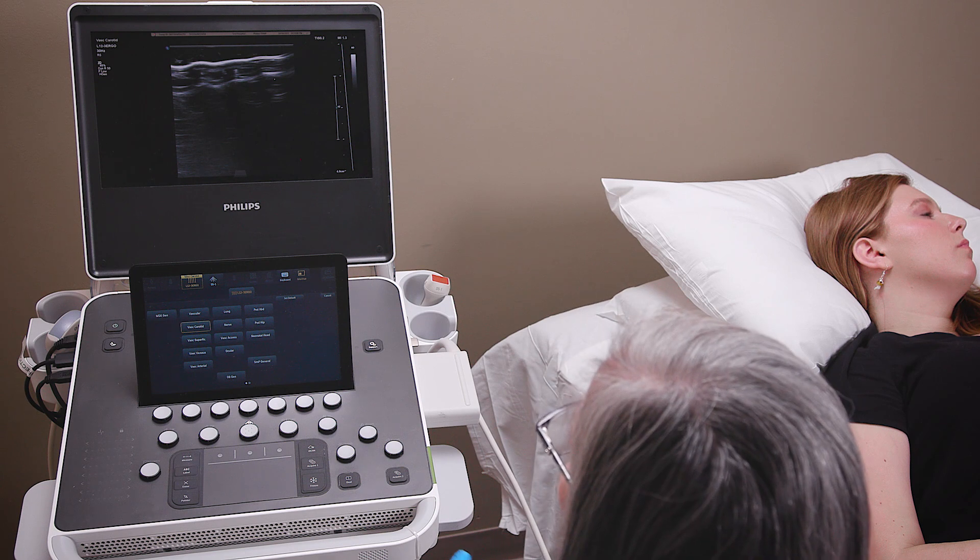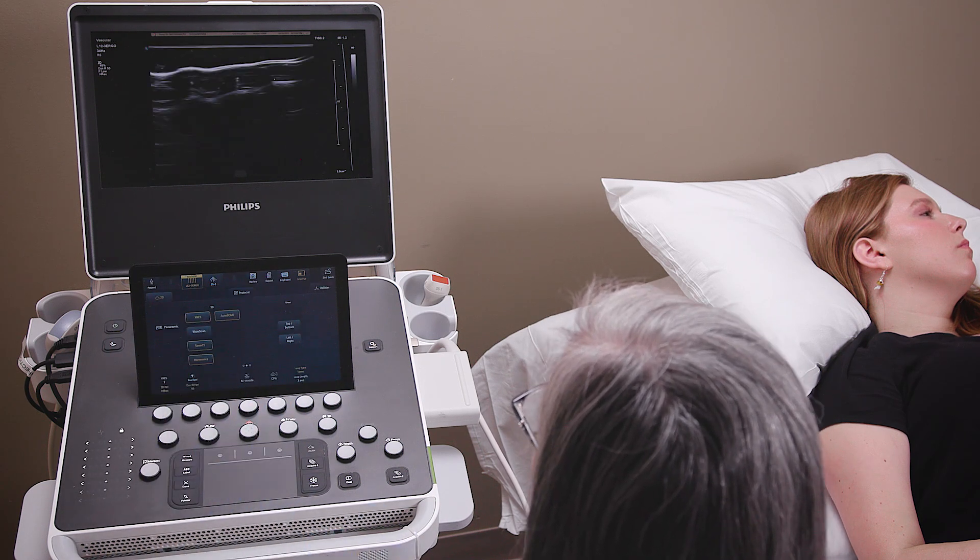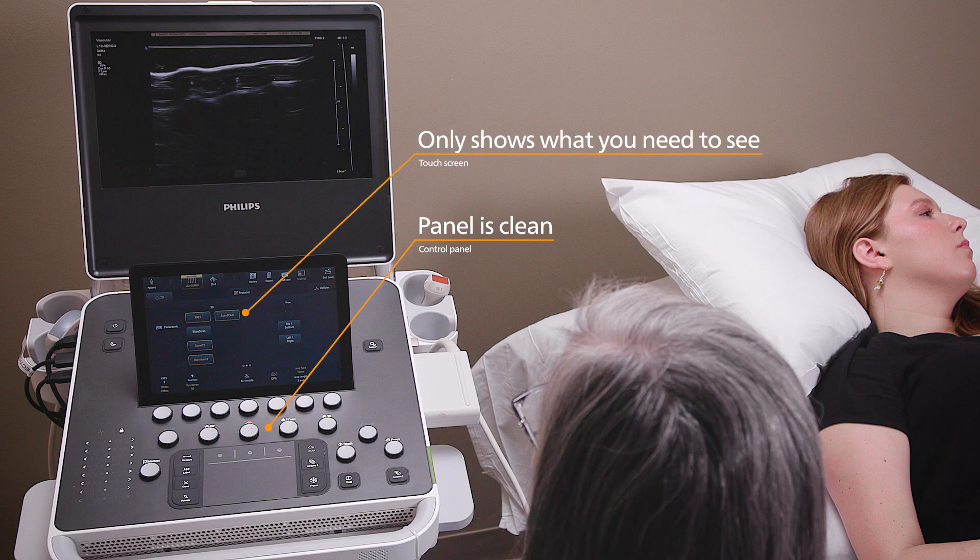Ready? Simply choose your transducer and respective preset. Note that the panel is clean and the touchscreen only shows what you need to see.